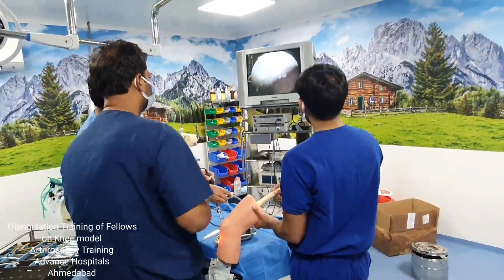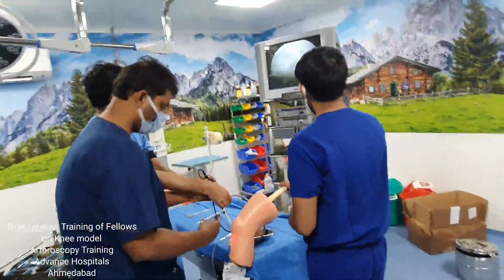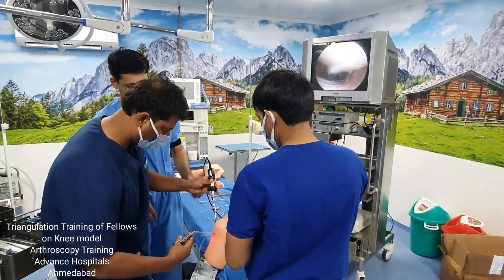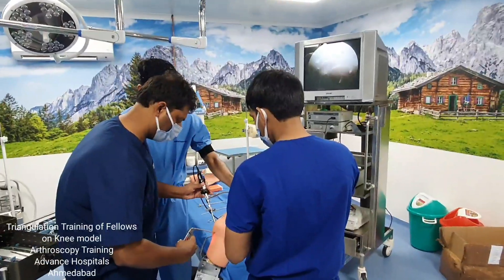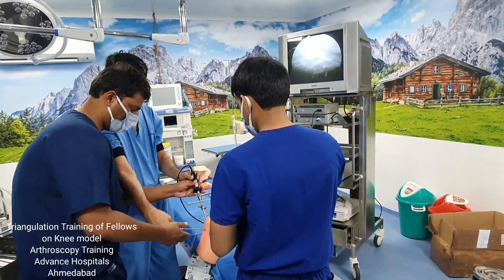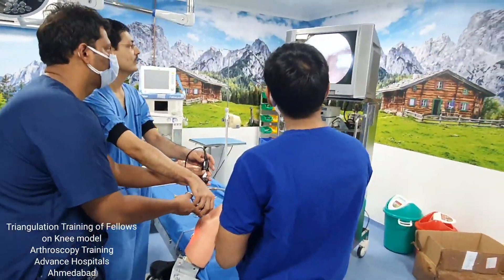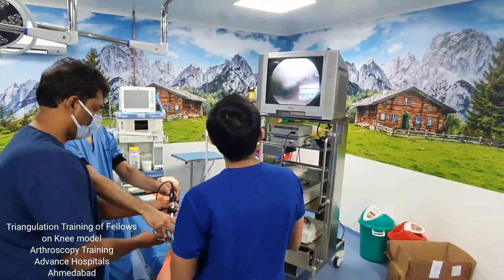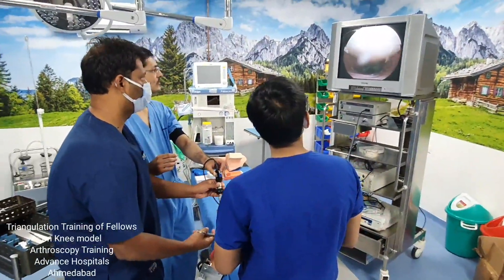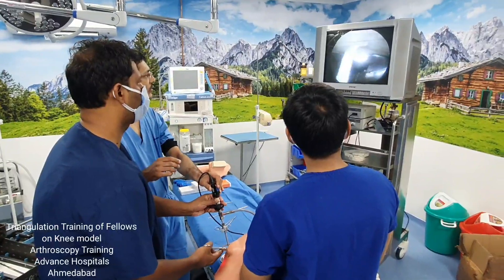This is what you need to focus on. This is your finger, this is your joint here, and you need to go into the joint. You need to focus on the tip of your instrumentation and then remove the small structures over there if possible.